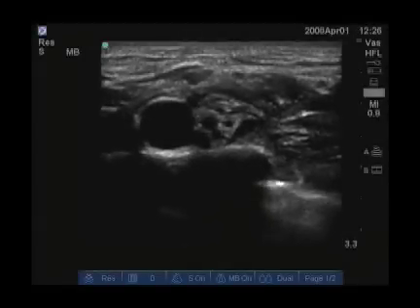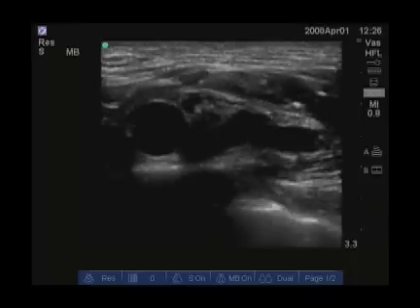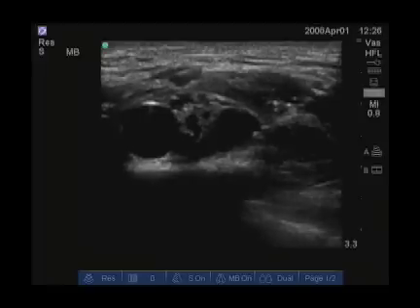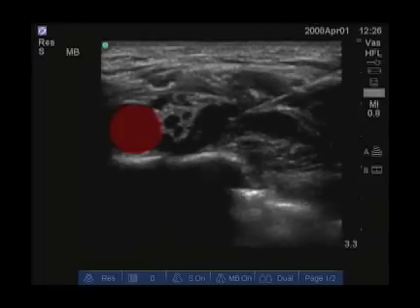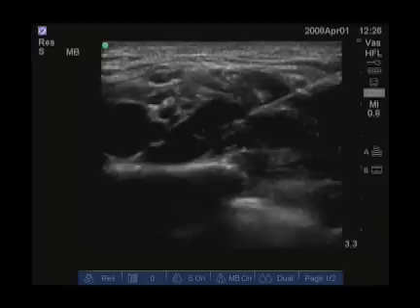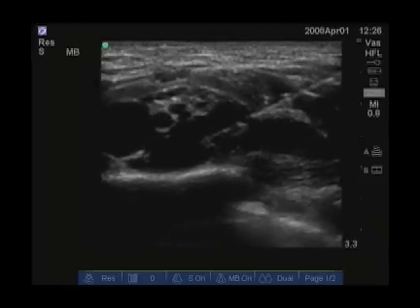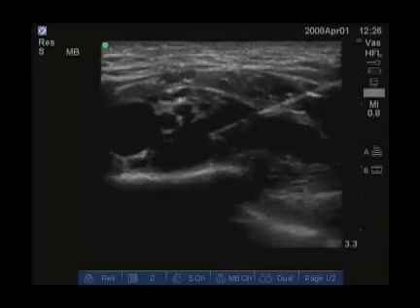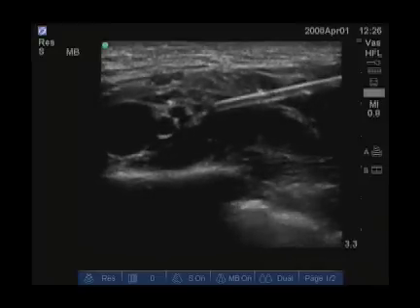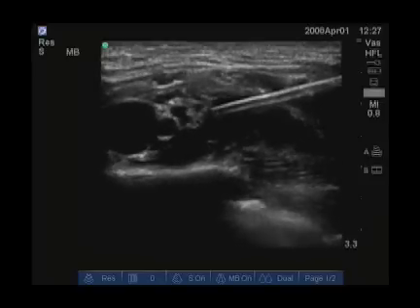This example of a supraclavicular injection: the first injection is lateral to the nerves. Our needle is barely visible because it is at a steep angle. As the needle is flattened out, we will see it better. You can see the pulsating subclavian artery sitting on the first rib and you can even see pleura out more laterally. As the injection is put into the pocket between the artery and the first rib, notice the artery is even lifted off the first rib during this injection. Now you can see the needle much better because it is at a flat needle angle. You can see the nerves just posterior to the artery and the hypoechoic local anesthetic spreading below the nerves.